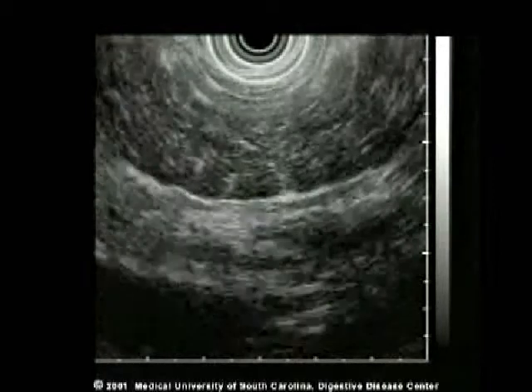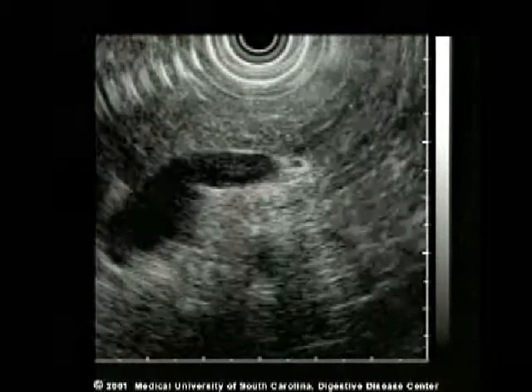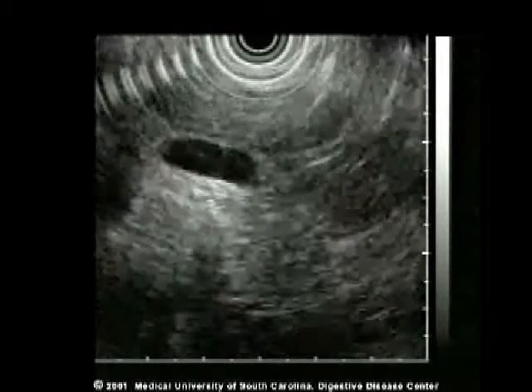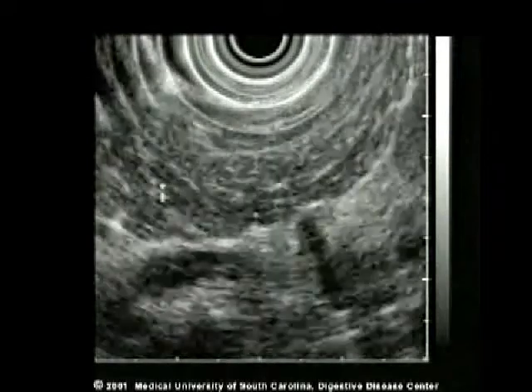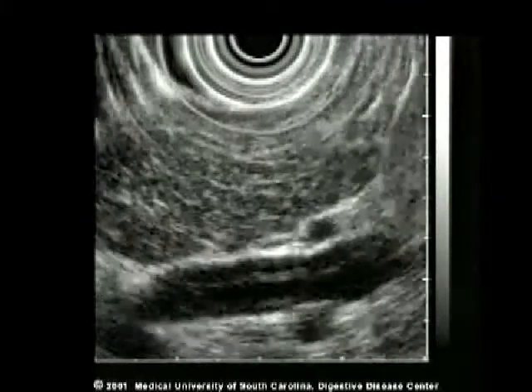Each video will demonstrate the body and tail of the pancreas and which features were agreed upon. Note the typical club head view with the splenic vein coming across the bottom of the screen. In each example, the pancreatic body is followed out to the tail by rotating the scope in a clockwise direction.